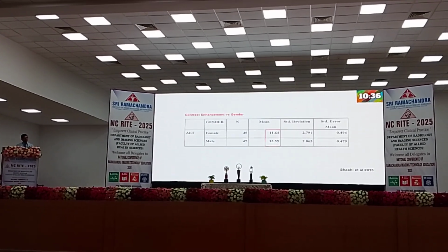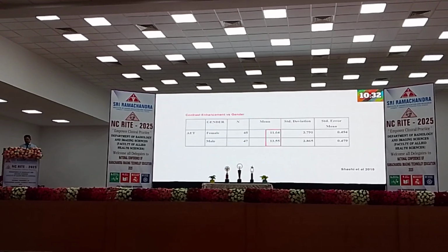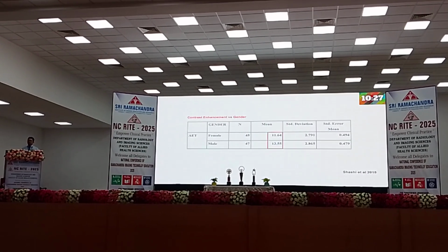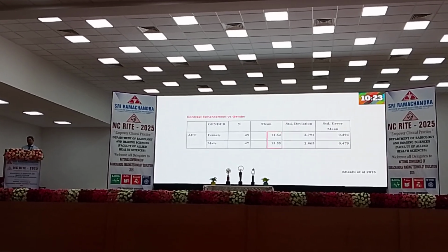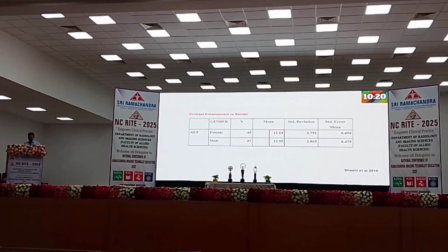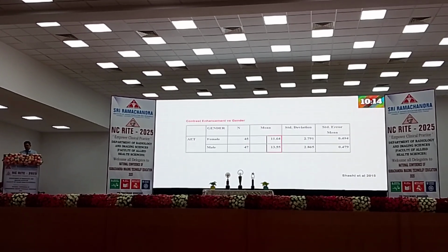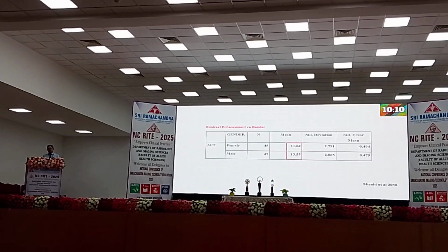Okay. And one more, the factors affecting the gender variations. As always, when you are doing the scan, please remember the male and the female contrast enhancement, even though you have a constant contrast as well as scan, flow rate, everything, it is not equal. You can see here, there is a study where the mean time for the female to reach the particular area is 11.64 seconds, whereas for the male it is 13.55 seconds.